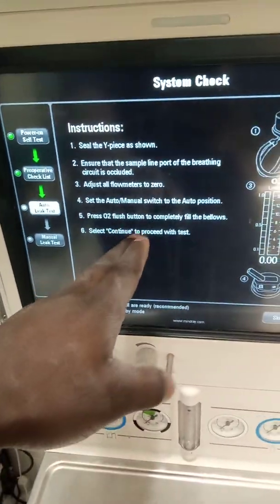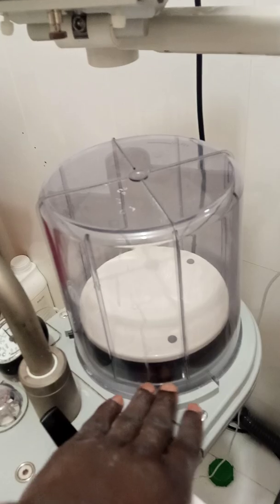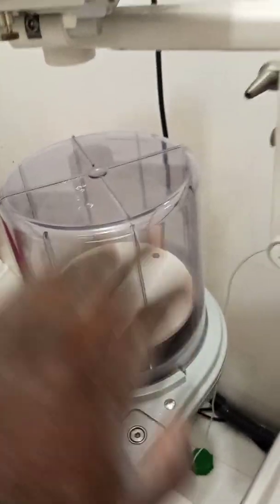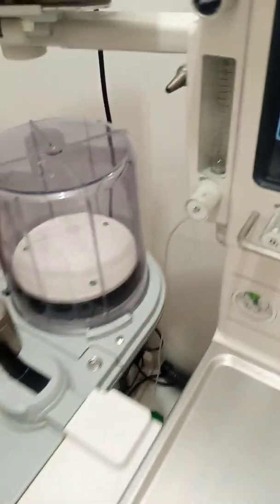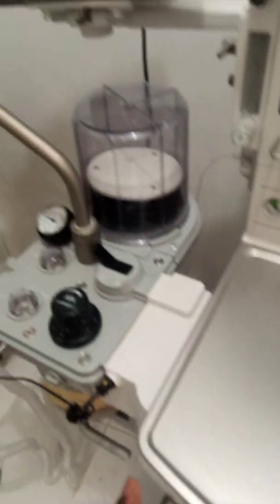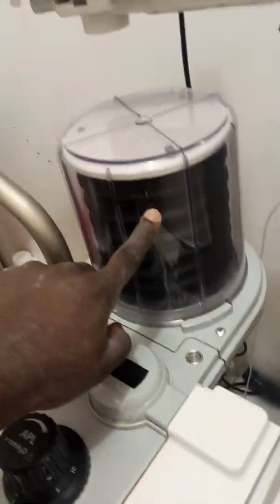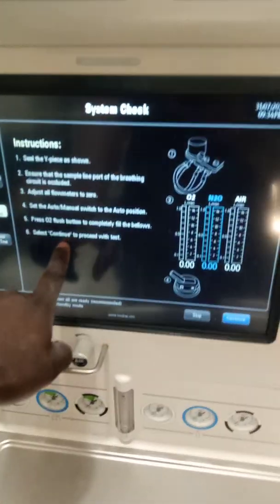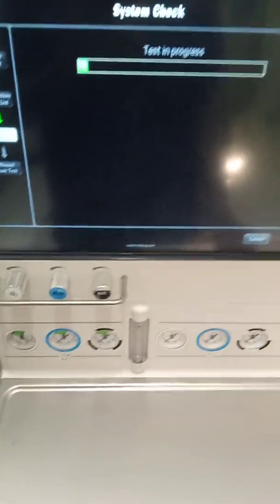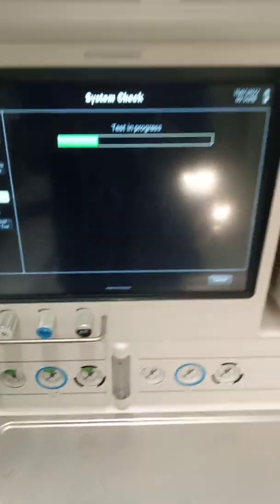Press the O2 flush button to completely fill the bellows. This is the bellow — these are the ventilator bellows. We are going to press the O2 button for it to be completely filled. Now, select continue to proceed with the test. We wait patiently whilst the test is in progress.